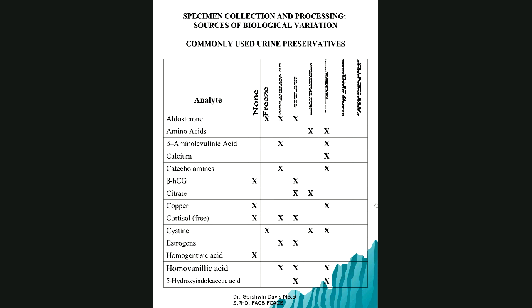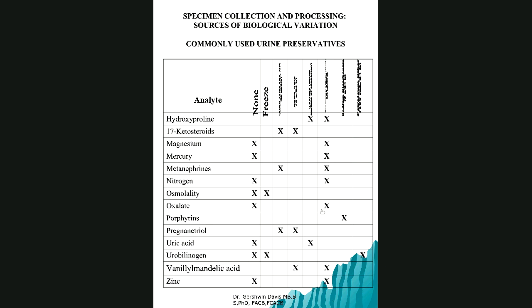And then you can give them the instruction. You don't need to remember all of these corrosive substances that are present in the container. You simply have to go to a reference text. If the physician orders citrate, what do I need to include? And it tells you. And sometimes no preservative at all. Reference books and textbooks will actually tell you that as well. So none, and a lot of it is HCl, and you have toluene, etc. So the point about the 24-hour urine collection is that it sometimes needs to have a preservative in there depending on what analyte you're collecting or testing for. That's the take-home message. And you can check reference textbooks for it.